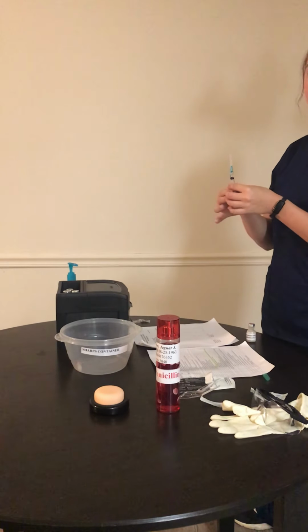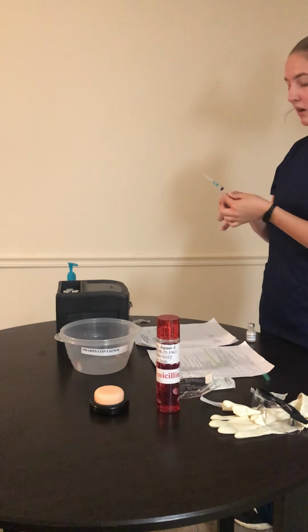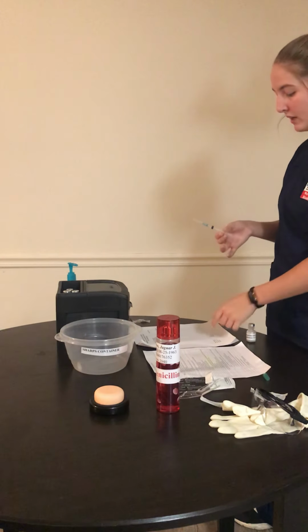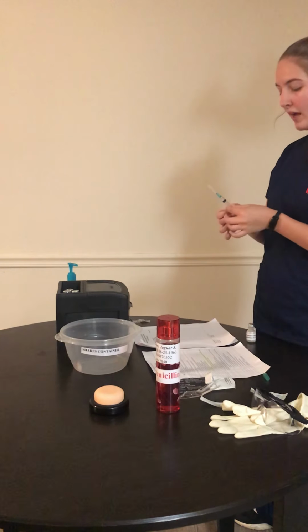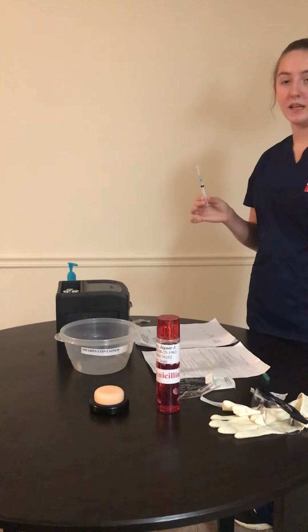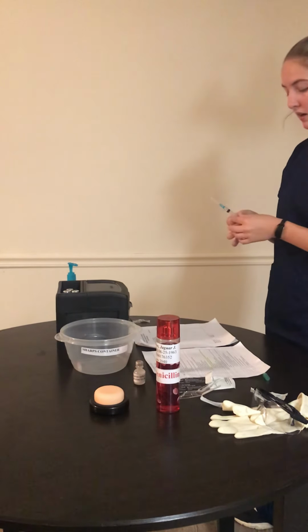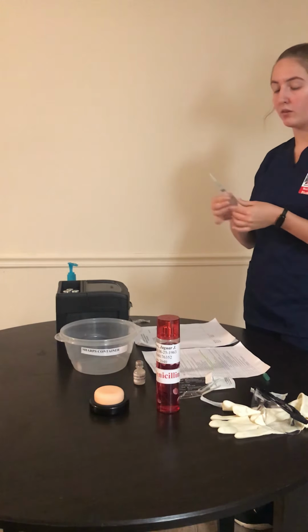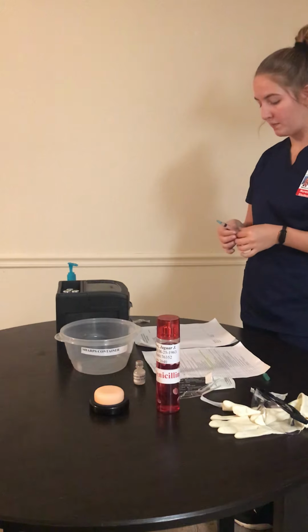After I have attached it to my syringe, I'm going to verify that this is the correct dose, half a milliliter, by checking it with my patient's form and my MAR. So 5 milligrams, 5 milligrams, and half of a milliliter is 5 milligrams, since this is 10 milligrams per milliliter. Now that I have done that, I will verify with another nurse to make sure that this is the correct amount, so I'm not giving the patient the wrong amount, and they will verify my calculations.